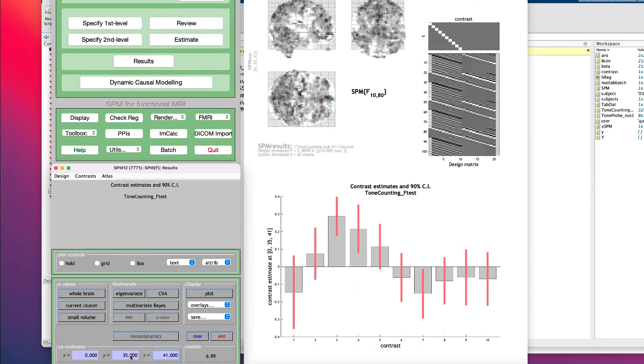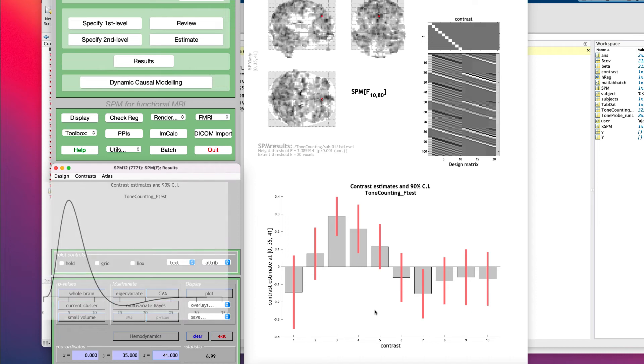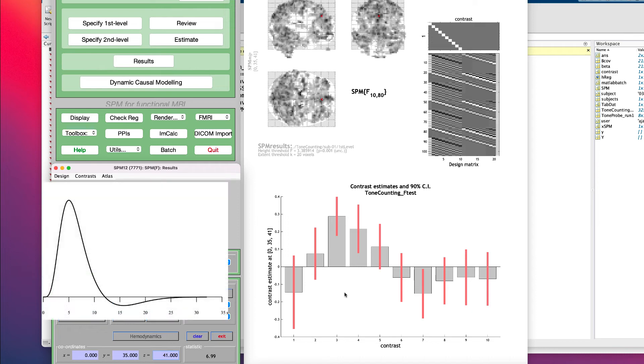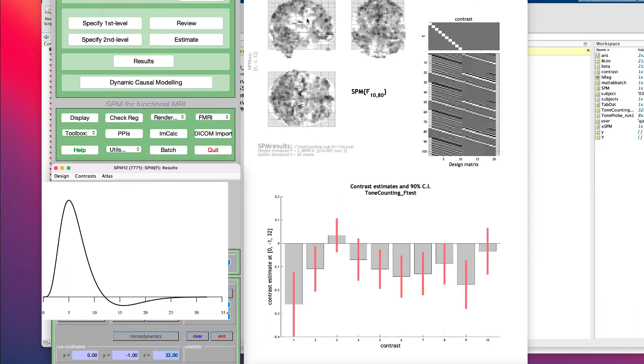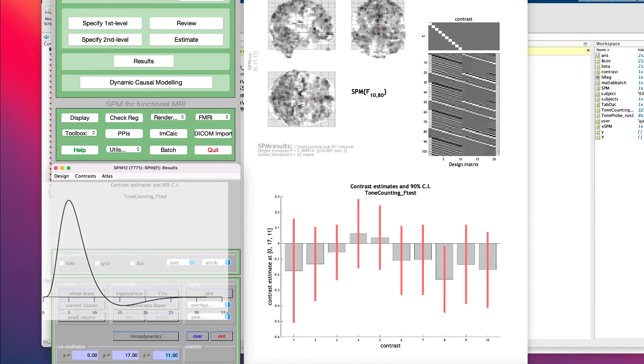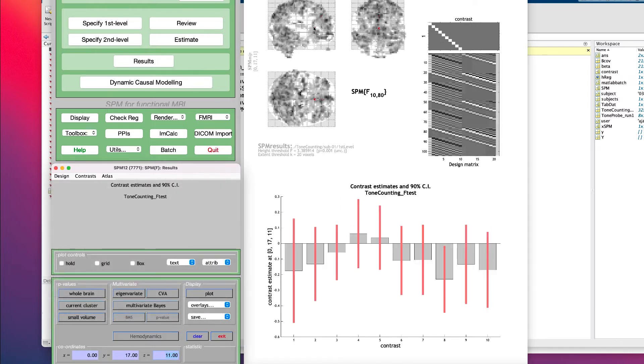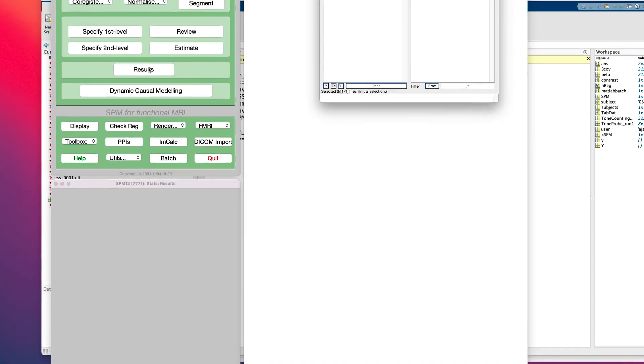For example, at the coordinates 0, 35, 41, the plot looks like this. Note how the overall pattern looks similar to the canonical HRF. There is a rise and a distinct peak around 3-4 TRs, corresponding to approximately 6-8 seconds after the onset of the stimulus, followed by a gradual decrease and undershoot. The pattern is not the same everywhere, however. Navigate around the brain and see the variety of profiles that have been estimated in this time window.